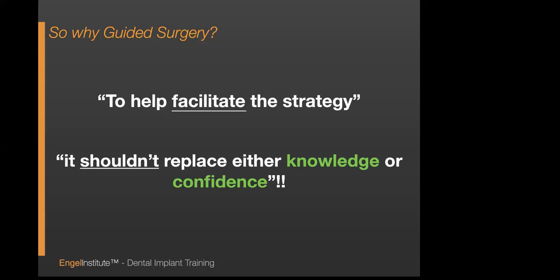If you come to one of my courses and you say, I want to do everything guided, this is a big concern for me. This tells me a lot. You should not feel this way. This is a guided surgery webinar, and I'm here to tell you that the approach towards guided surgery should be to help facilitate it for you, not to do it because you don't know how.